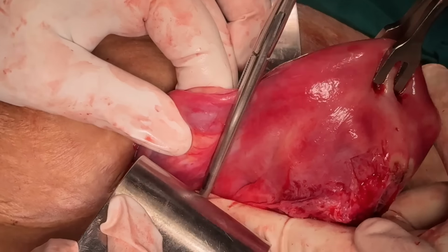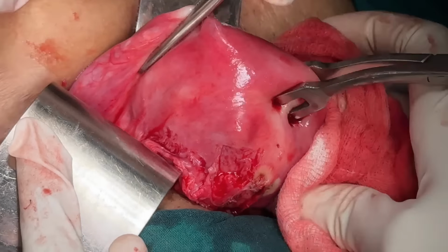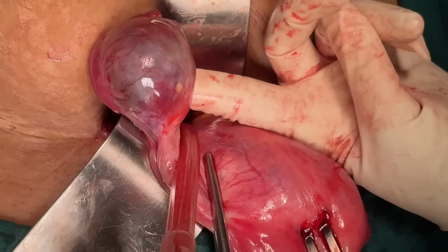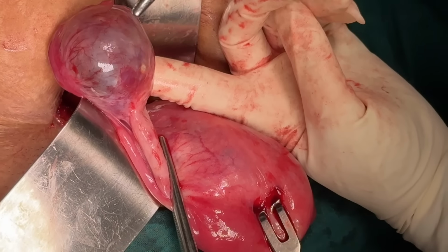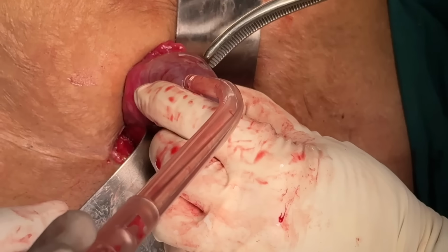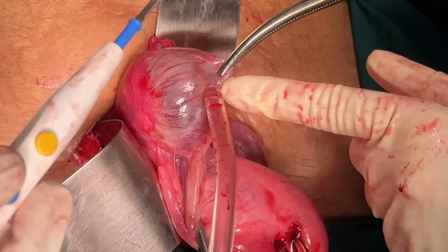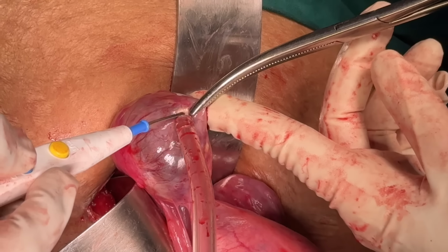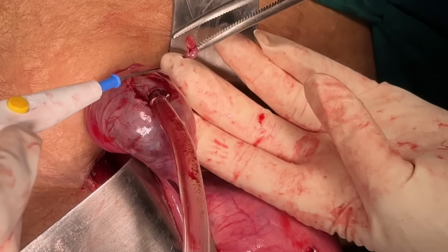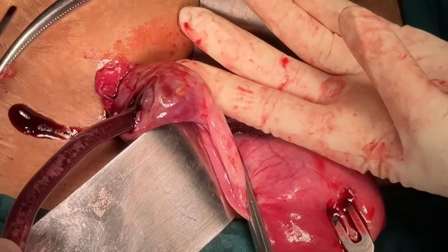The first step is clamping the cornual structures. The first clamp we put is the straight clamp to prevent the backflow from the uterus. Now, as the patient has a cyst in the right ovary, the plan of removal of this ovary has already been discussed with the patient. So what we are doing here is trying to decompress or aspirate the cyst. And what is the advantage of doing this? We get more space when we put a clamp on the infundibulopelvic ligament. We have already seen and understood that this is just a hemorrhagic cyst, so draining it is no problem.